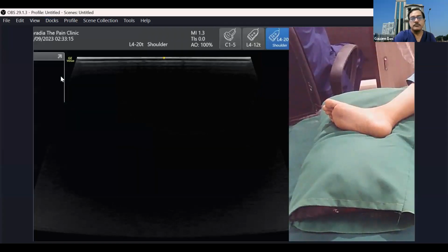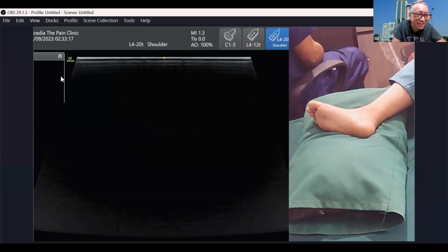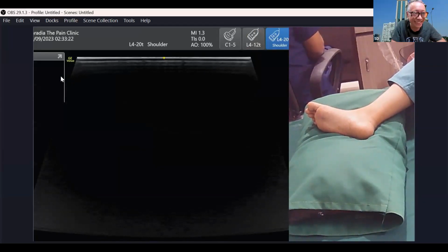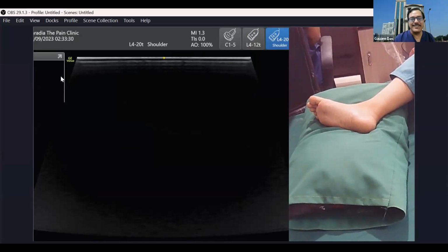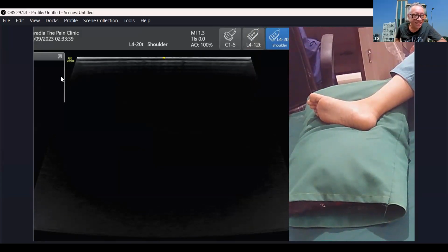Sir, this is not Sanjeev Das's foot. Yes, Sanjeev Das's sole is much thicker, so almost nothing is visible. This is the sole of a younger lady, who has a thinner sole, so that we can see the plantar surface nicely. Okay. Yes, sir. So you identified that this is not Sanjeev Das's foot. Yes, sir.